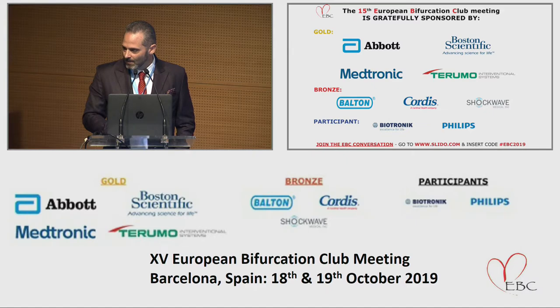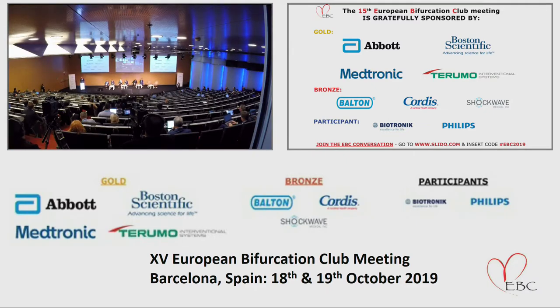So, Gianluca, I want to discuss a bit the name and the simulated case you showed. What I've seen on the simulation is that there was no lateral crush, which is the definition of the crush. When you re-enter the side branch in the crush, you enter in the lateral cell, not in the lumen of the stent. So what you got here is probably a modified T. Some concertina crushing, as John Armstrong called it. So it's a longitudinal crush of the side branch, which is slightly protruding, and when you re-enter in the distal lumen of the stent. And of course, it looks very much like what Antonio Colombo described a long time ago, which is modified T.